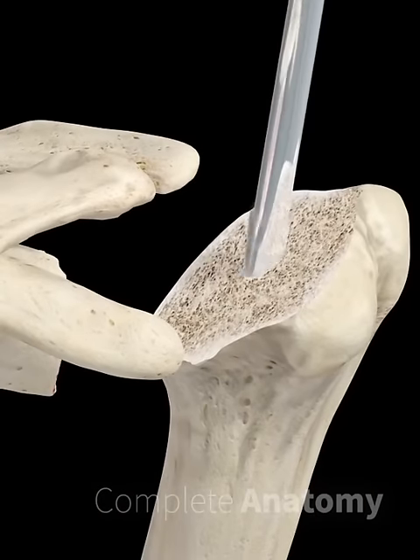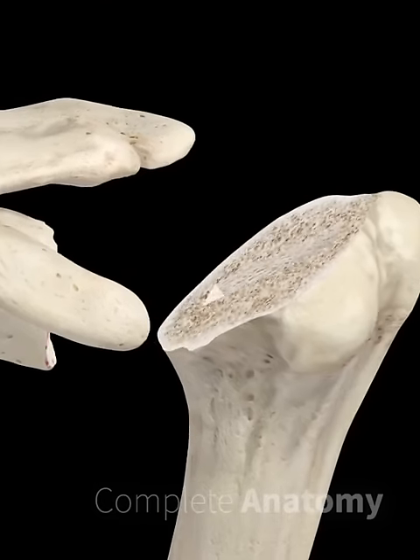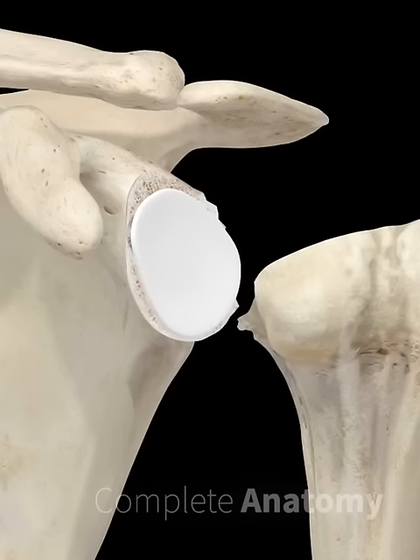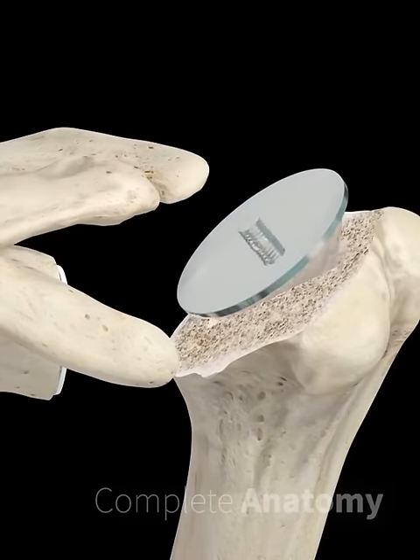The procedure involves exposure of the shoulder joint and removal of the damaged or arthritic parts of the humerus and glenoid cavity. The glenoid cavity is resurfaced with a polyethylene prosthesis. A channel is created in the humerus bone to hold the stem of the metal prosthetic.